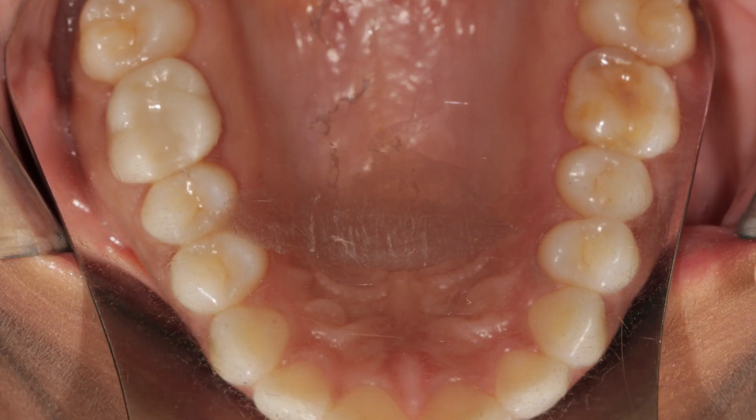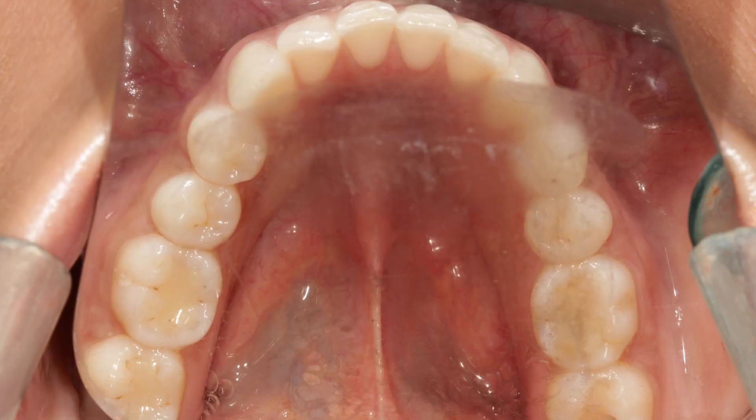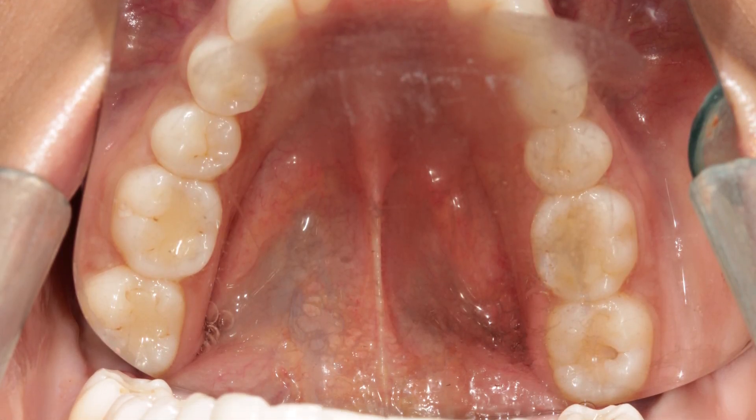Check your photos on your camera before dismissing the patient and retake any shot you are not happy with.